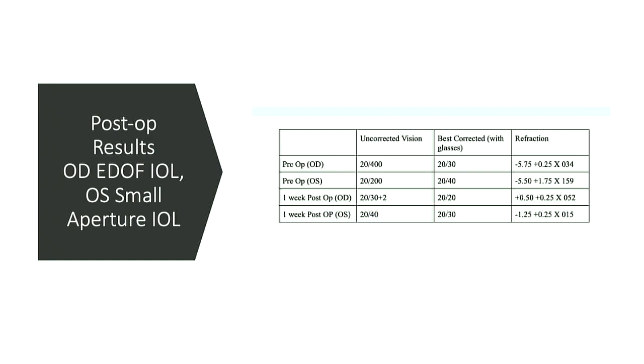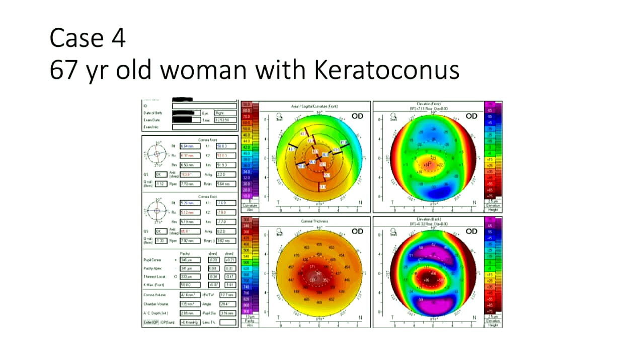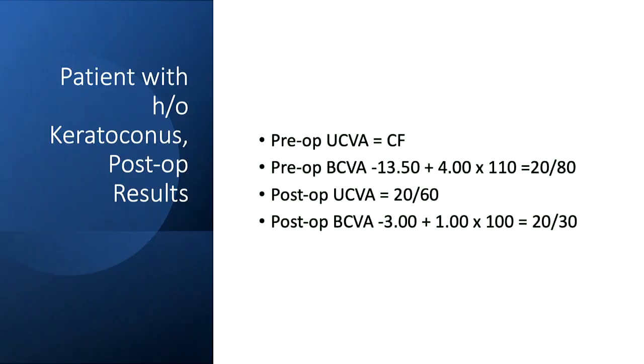I think I put a Vivity lens in there, and you could see that there was definite improvement post-op for both the EDOF, the normal right eye, as well as for the small aperture IOL. Again, for this patient, I chose slightly more myopia and also wanted to emphasize that the goal is to improve but not perfect.